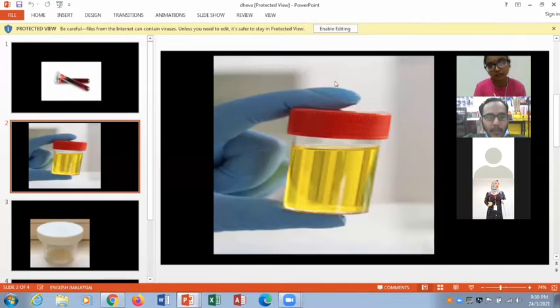For urine, it is recommended to use a primary collection container that holds at least 50 ml and has a wide base and an opening of at least 4 cm. A wide base prevents spillage, and a 4 cm opening is an adequate target for urine collection. A 24-hour container should hold up to 3 liters. A sterile collection container is recommended for microbiology specimens.